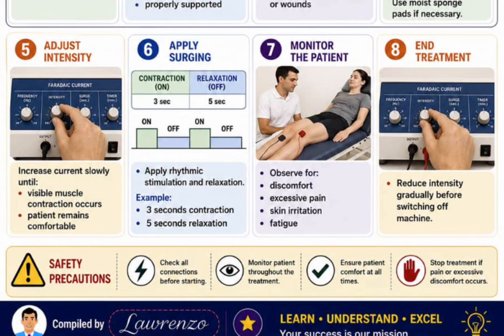So you have to monitor the patient all through. You observe for discomfort, excessive pain, skin irritation, and muscle fatigue. So you'll be there. The next one, now you have to end the treatment. When you end the treatment, you have to reduce the intensity, and gradually turn off the machine.